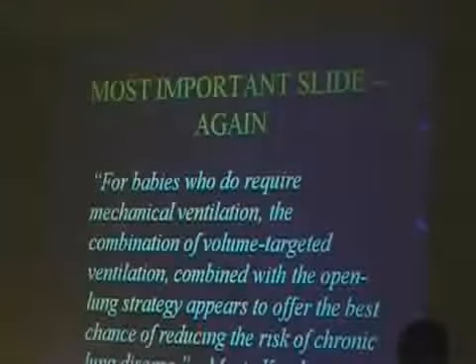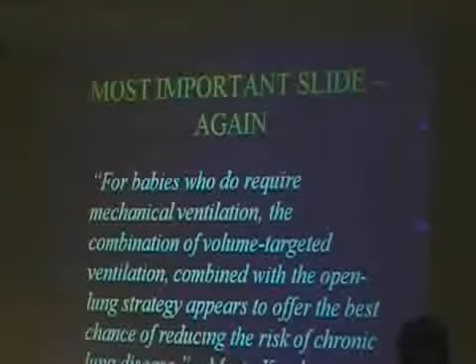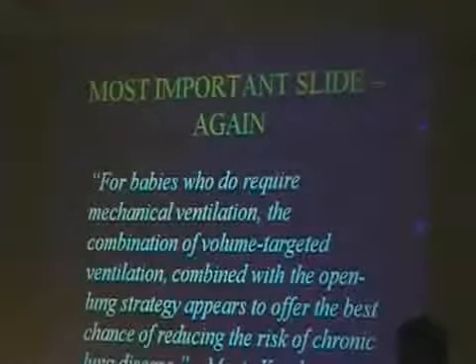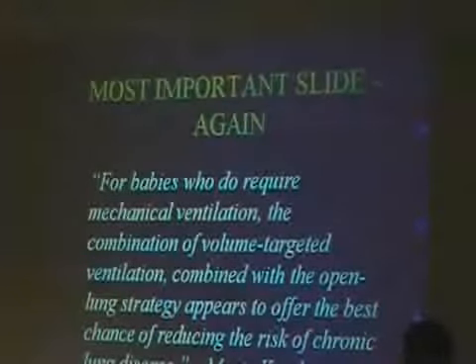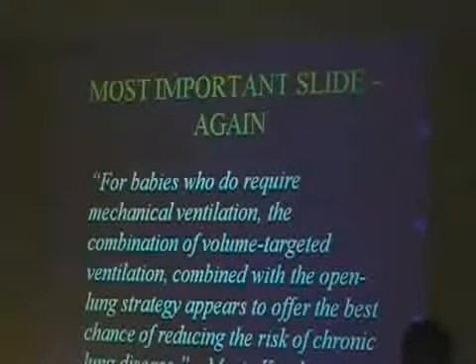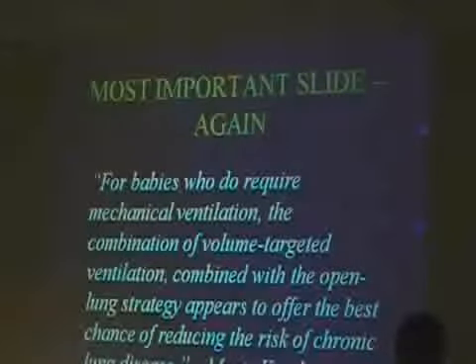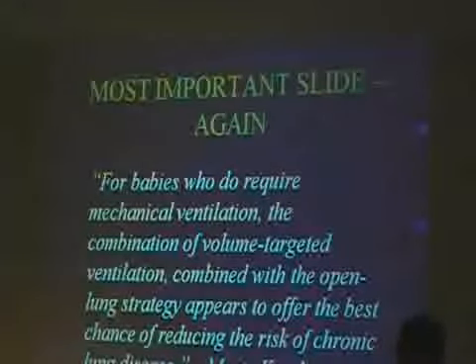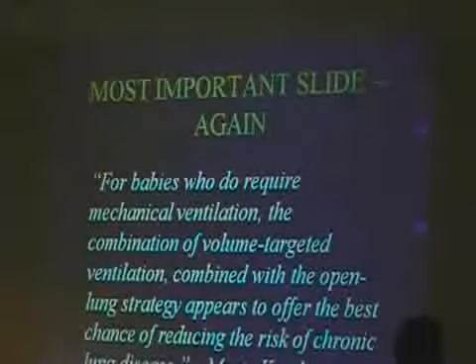All right. So you set a PIP upper limit. The most important thing is setting your tidal volume, and then the machine will adjust the PIP by itself. And it will also wean the baby. Think about it: if it's adjusting that PIP, then as the baby's compliance improves and as the baby gets better, the PIP needed is going to go down. So it's an auto wean mode. The ventilator will take that PIP right down, because it's only going to deliver what PIP is needed to deliver the tidal volume that you've set, which is the beauty of it. So it is a pressure mode. It's an auto wean, auto regulated mode.